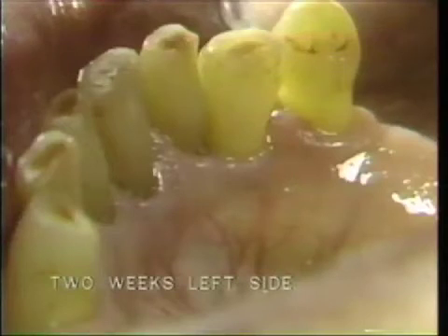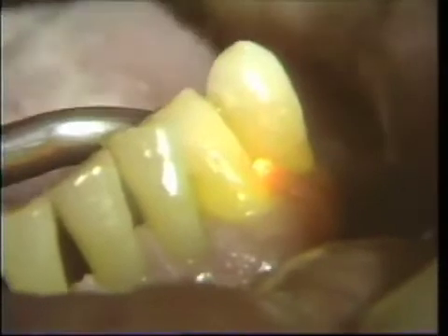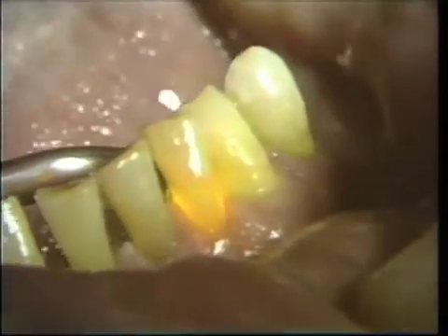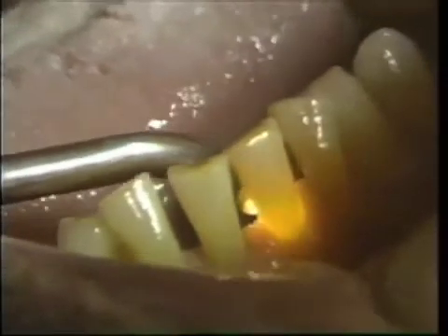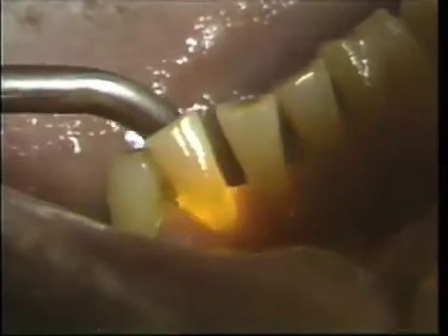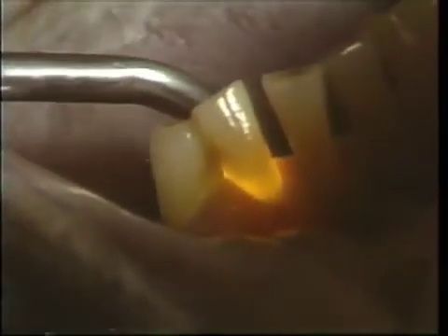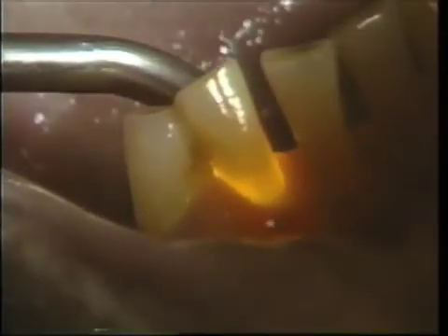This shows two weeks after the scaling on the left side and one week on the right side. Again, double checking with the fiber optic for the presence of subgingival calculus on tooth number 26.